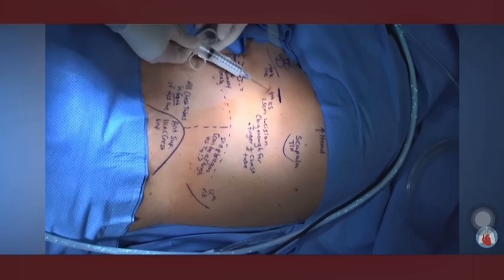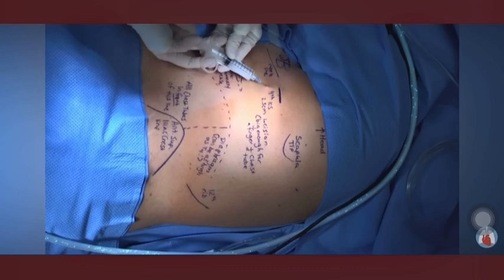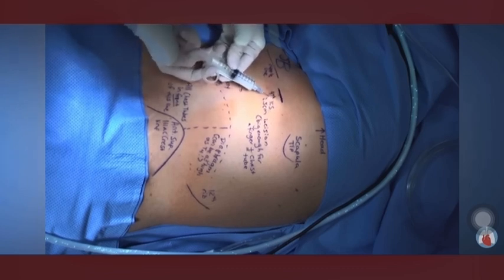For patients who are intubated and asleep, you have the benefit of general anesthesia. For awake patients on the floor, chest tube insertion can be performed in a comfortable manner without the use of sedation if local is performed properly.